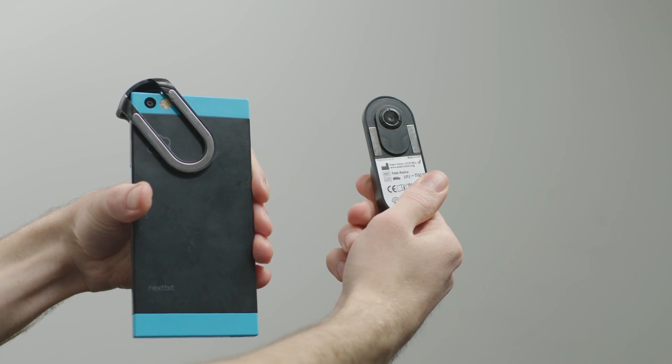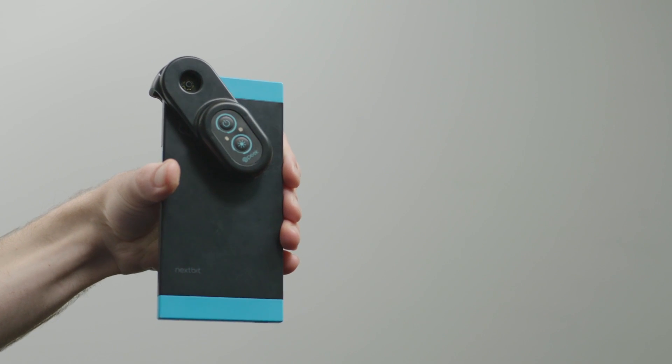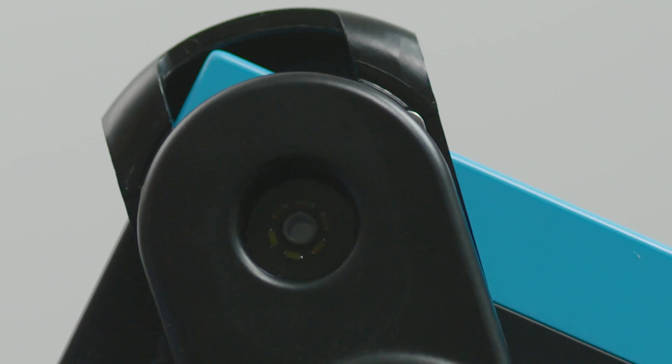Peek Retina has magnets on the back. Attach these to the magnetic metal strip on the clip. The Peek Retina examination lights should be directly over your smartphone camera lens.